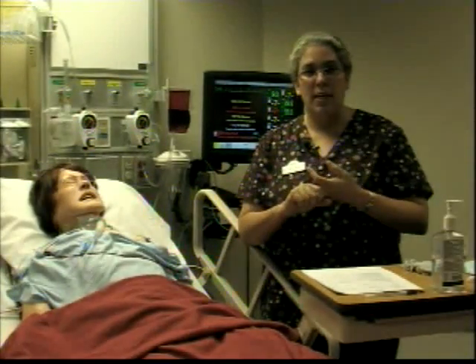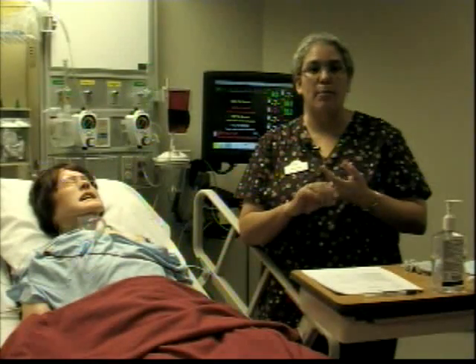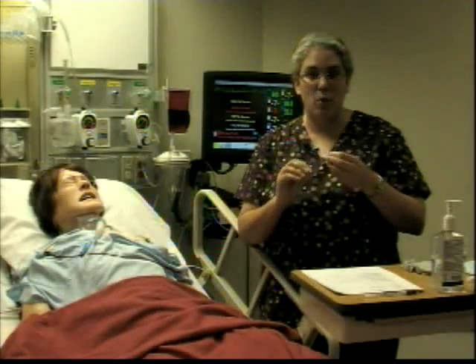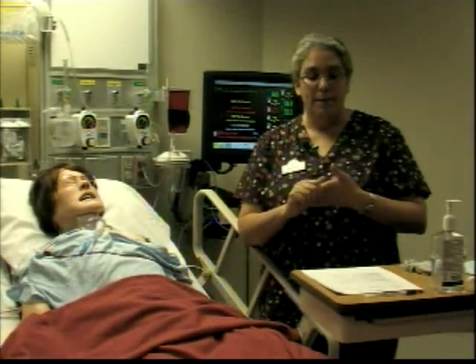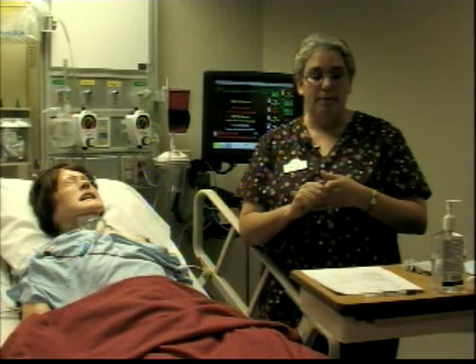If there is any issues with the line itself, for example, if there's any ports that are clamped because they're clogged, or there's some reason or some specific way to administer fluids or to draw blood from that line. How long has it been in there? That will be for the date.